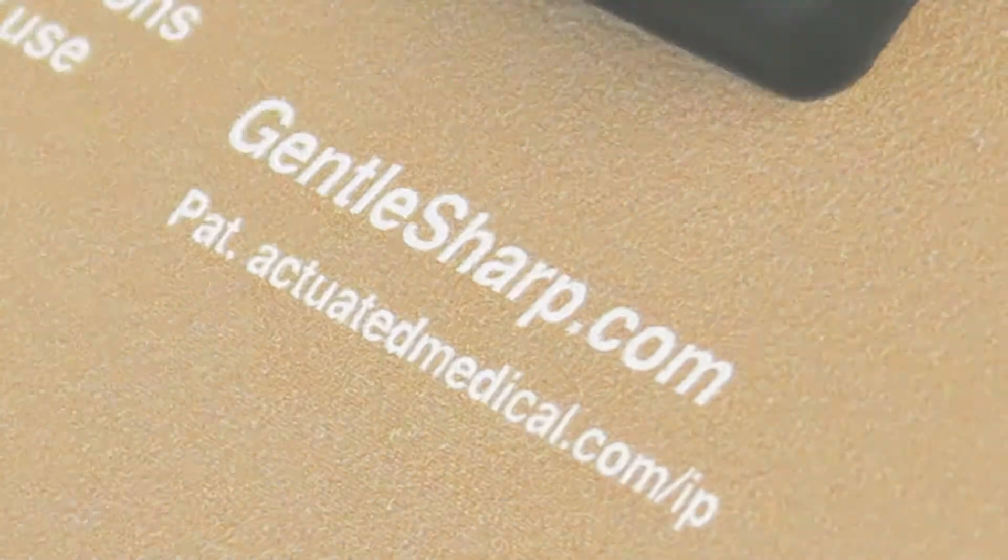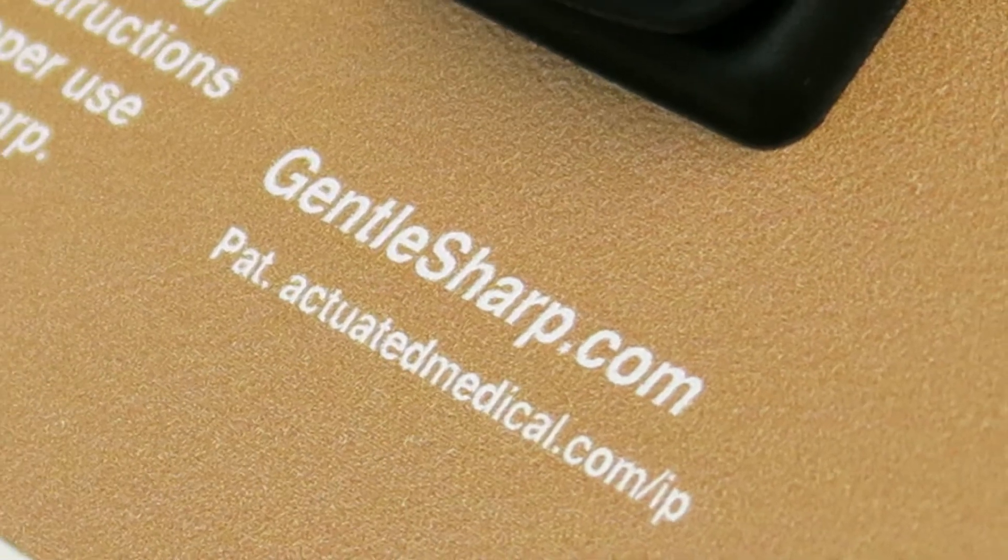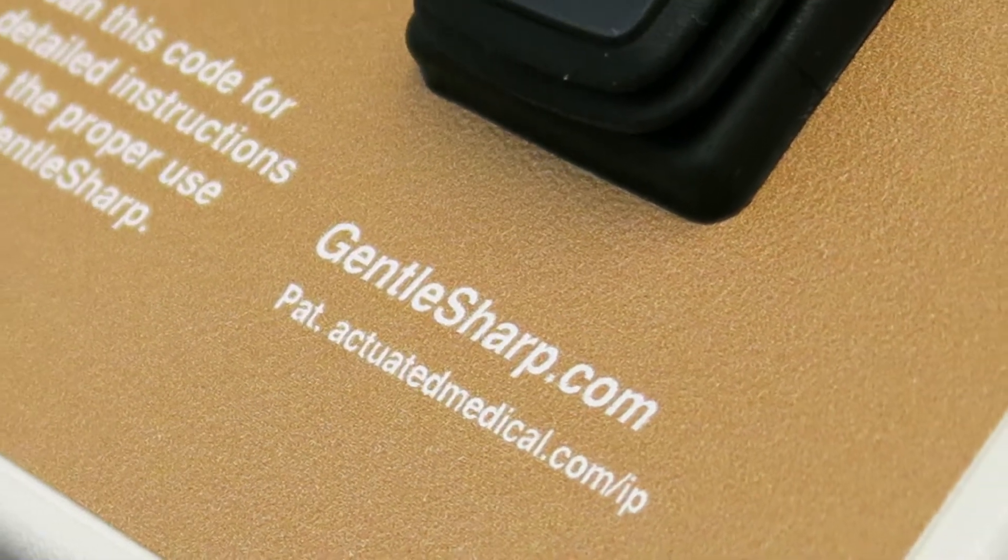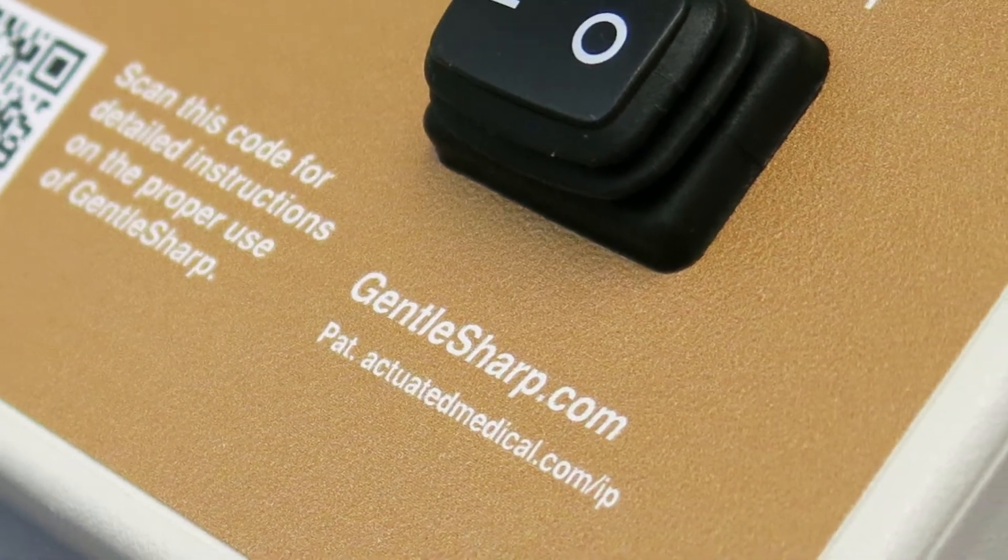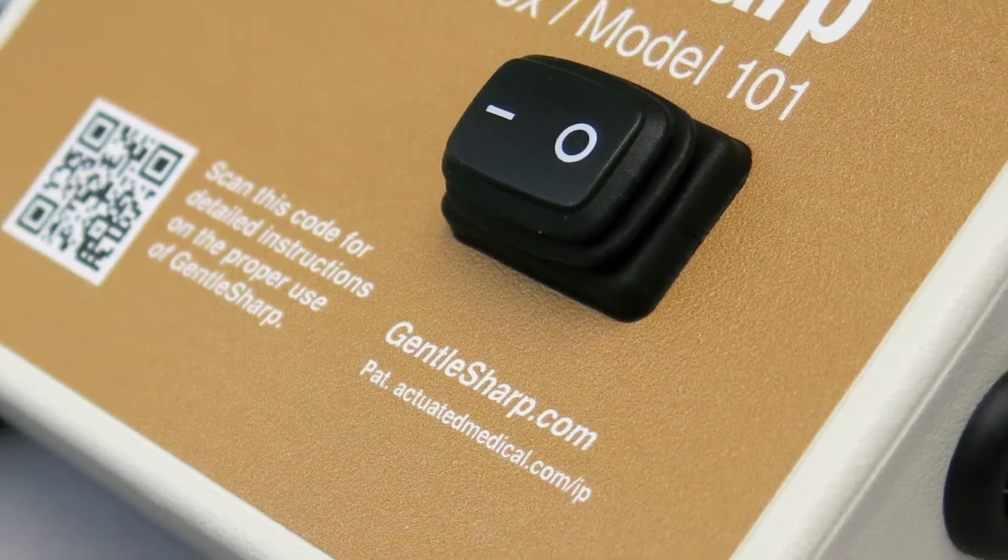Do not use if the site you wish to sample contains abnormalities, you are collecting blood via retroorbital bleed, or the device is in the presence of flammable anesthetics.